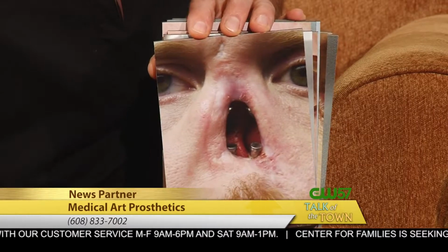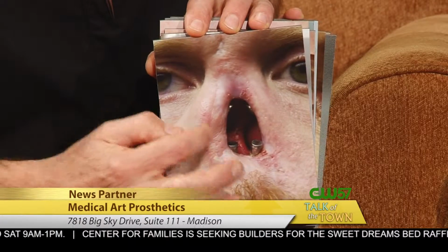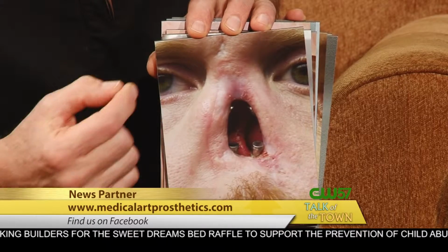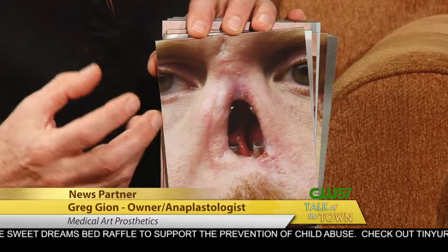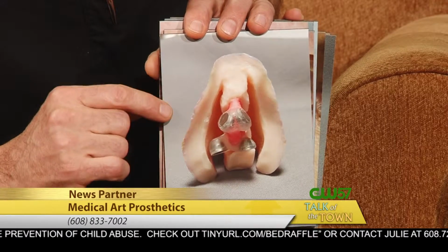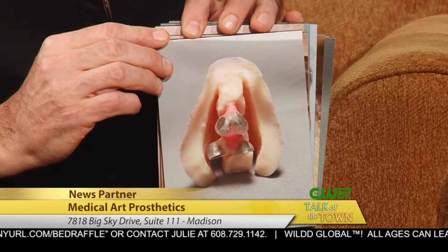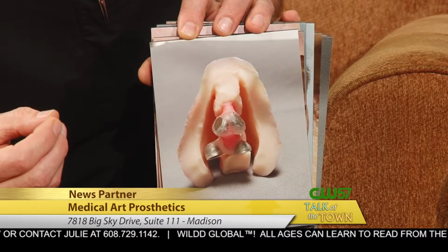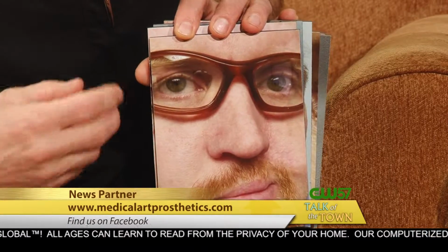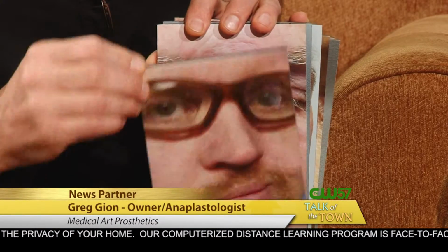Another method is some of our patients have osseointegrated implants placed into the bone inside the nasal aperture, and this allows them to attach their prosthesis magnetically without having to rely on adhesive. Isn't that amazing? The back of the prosthesis shows the 4 magnets that correspond to the implants. It's a really beautiful way to do it if you're going to wear a prosthesis for your life. Very quick and easy. Exactly. Lifestyle is much easier. And there's the finished result there.